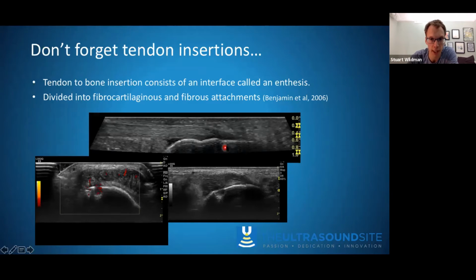So this is a normal Achilles tendon. It's also worth just mentioning that's a normal appearance. It's darker. It's not tendinopathic or pathological change. It's purely the angulation of the distal fibers attaching to the calcaneus there. It's my poor scanning, basically, which is why that is a dark tendon at that point.